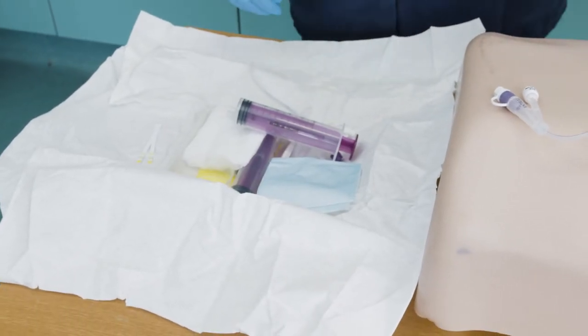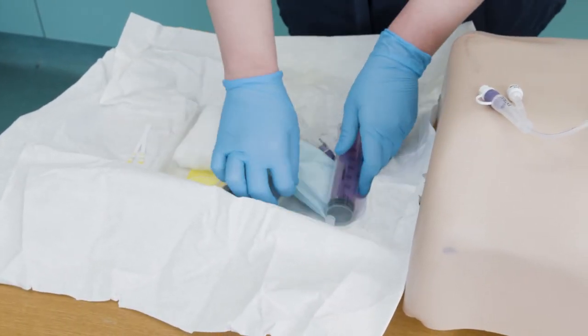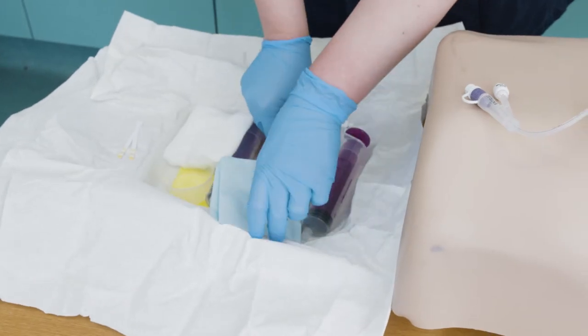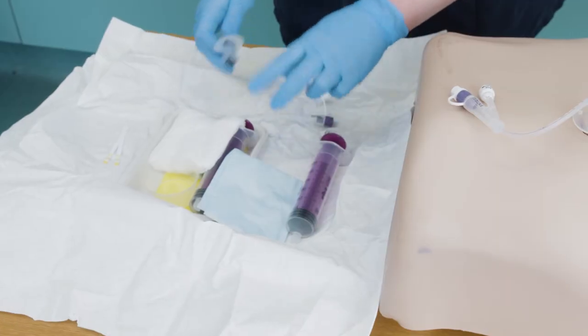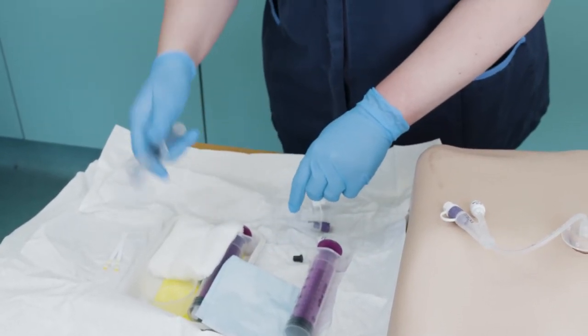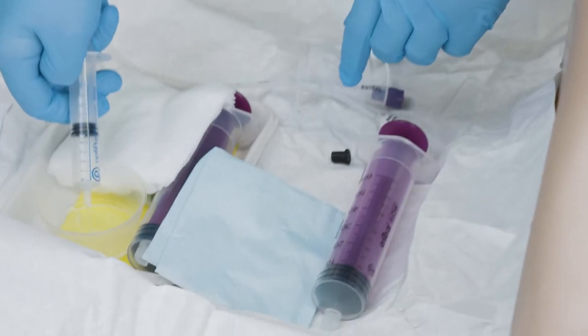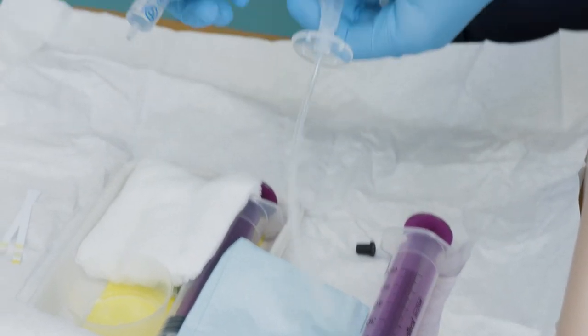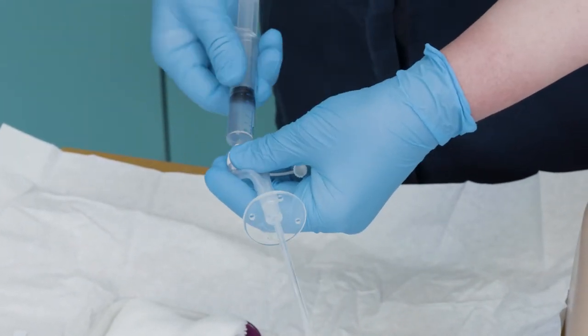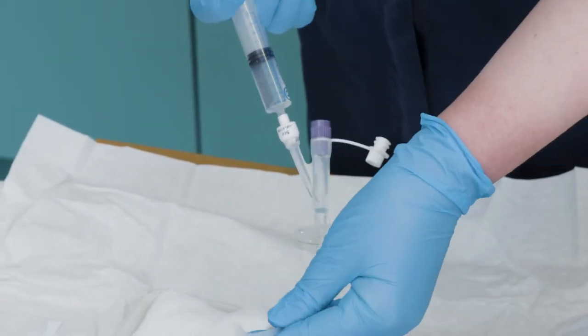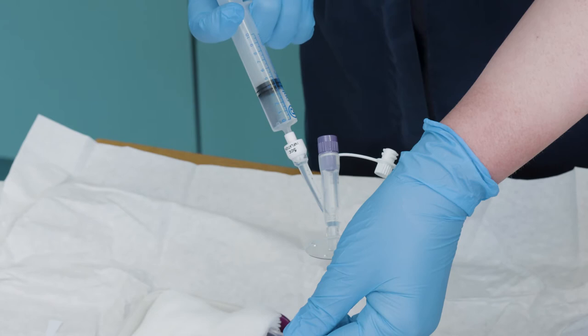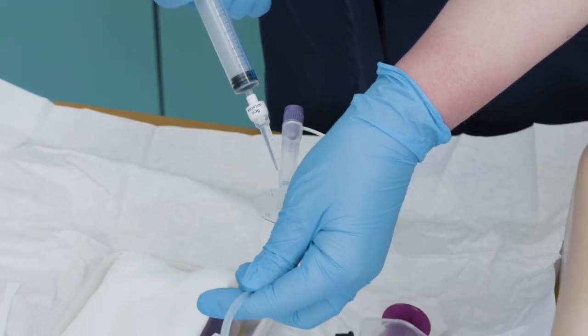Check the balloon on the new tube by inserting the manufacturer's recommended volume of water for injection into the inflation valve using one of the two Luer slip syringes, i.e. the one filled with water for injection from the gastrostomy pack if available. The recommended volume of water will be on the balloon valve. Ensure that there are no leaks in the balloon and that it is symmetrical.